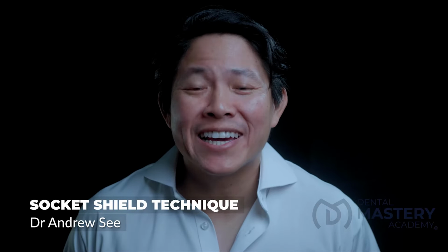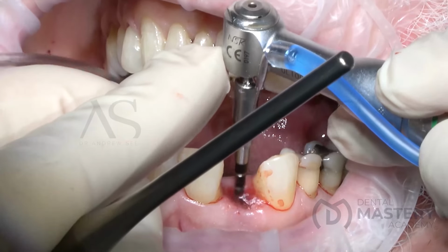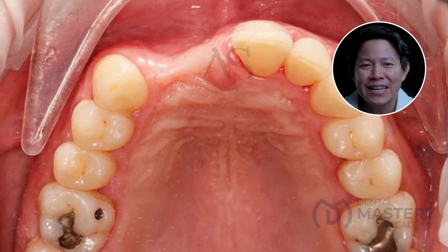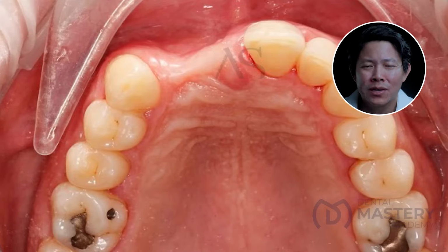For the last 2 decades, the biggest pain point for me with implants in the aesthetic zone has been trying to maintain the buccal bone and buccal contour. If you lose the buccal bone, then it can become unaesthetic because you can see a concavity or large divot in the buccal bone. This is not good in a high smile line case.